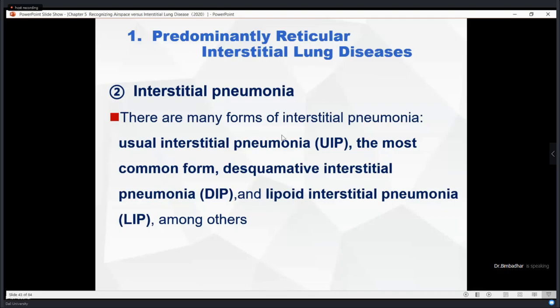Last time we were saying, okay, pneumonia is an airspace disease, and now we are talking about the pneumonia that is happening in the interstitium, right? So it is somewhat contradictory and causes confusion. Actually, you have to understand it is a pneumonic disease with a pneumonic pattern along with an interstitial component that is associated with it. Okay?